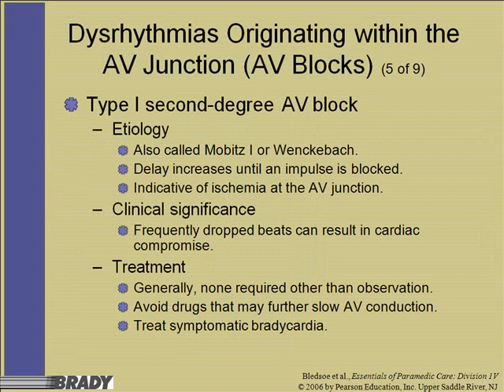Again, Mobitz 1 or Wenckebach, I can remember Wenckebach better. Delay increases until an impulse is blocked, indicative of ischemia at the AV junction, so we've got a choking or a problem there where we don't have good perfusion. Frequently drop beats can result in cardiac compromise, so generally there's nothing that we do on a regular basis for this, but we need to observe the patient, make sure they don't get into a more dangerous block.